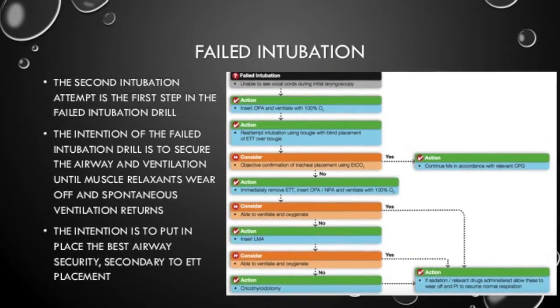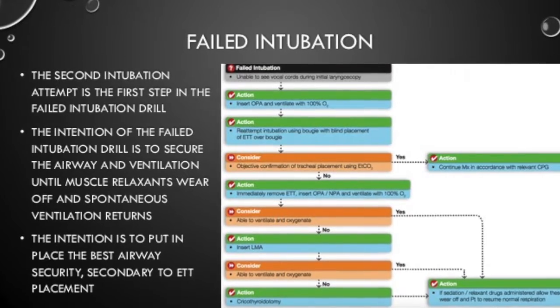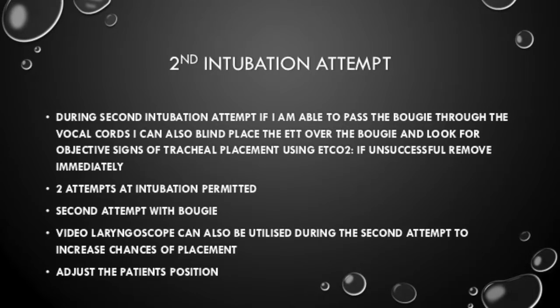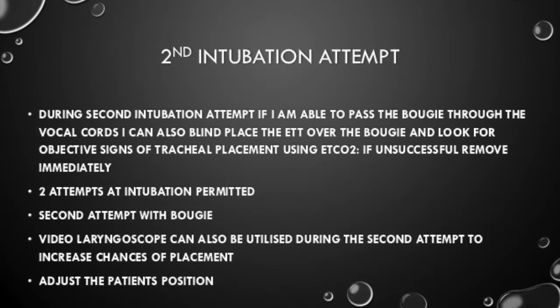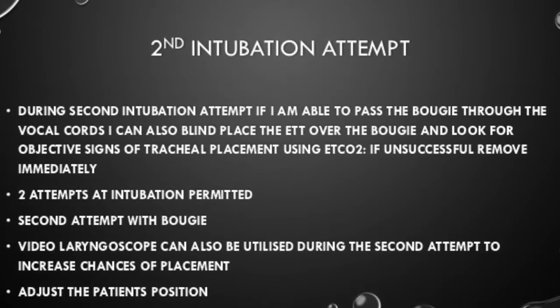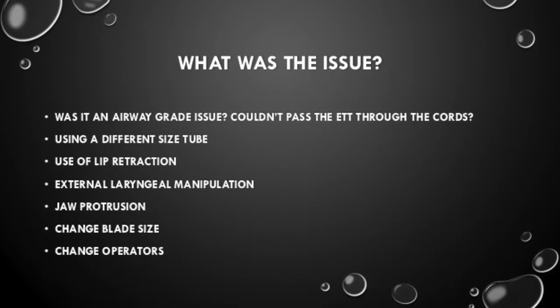Here is a guideline for the failed intubation drill. Once a second intubation attempt has been undertaken, this is the first step of the failed intubation drill. After your first intubation attempt is unsuccessful, you've got to ask yourself, what was the issue?